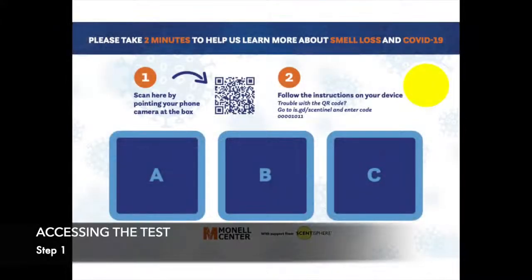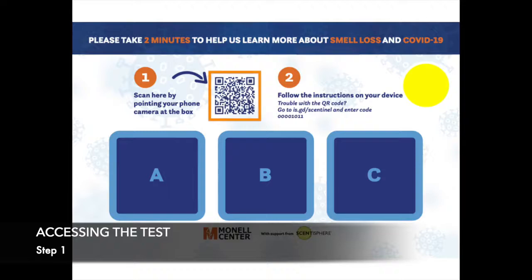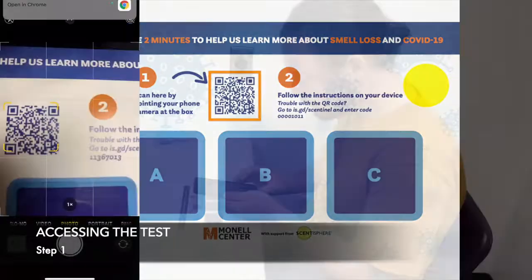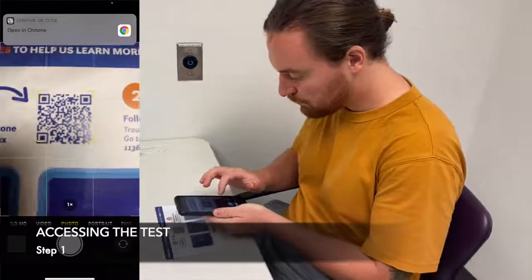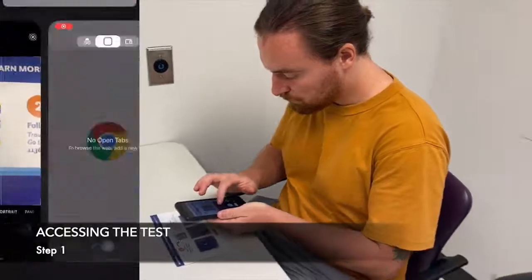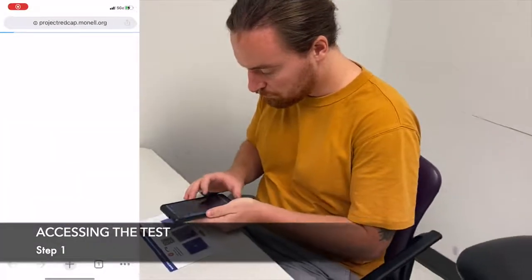The first step will be accessing the test online. You can use the camera function on a mobile device to access the website with the QR code in the center of the card. When the QR code is recognized, you'll be directed to our website.